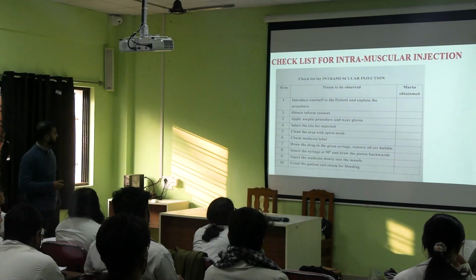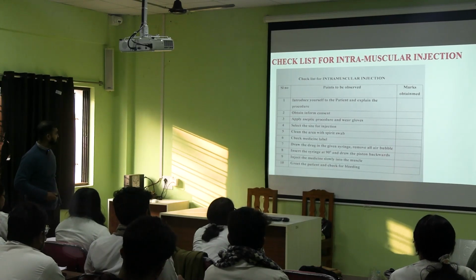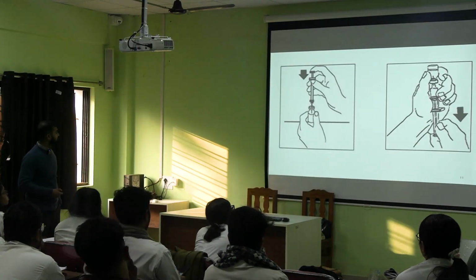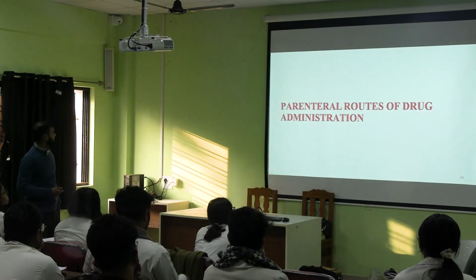Draw it, and here is a checklist for intramuscular. So this you have to maintain according to the steps. This will carry marks in your exams. This is how you take from the vial. No need for infusion.